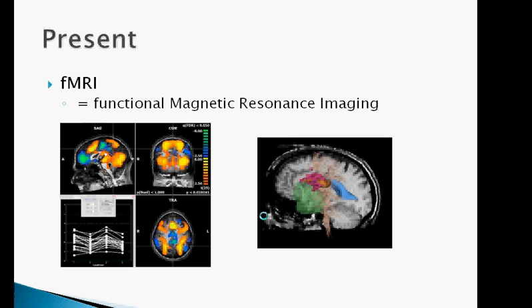So now the scientists are able to target active areas of the brain and blood flow, and it's based on the concept that the blood content has different levels of oxygen, so they are able to track that through functional magnetic resonance imaging. With this tool, they are able to track tumors, seizures, Alzheimer's, plan surgery, analyze emotions, and much more.